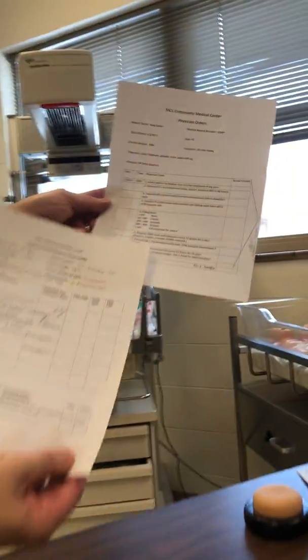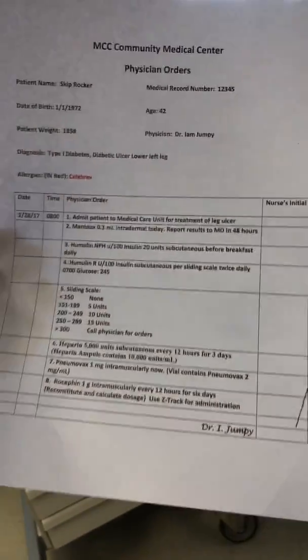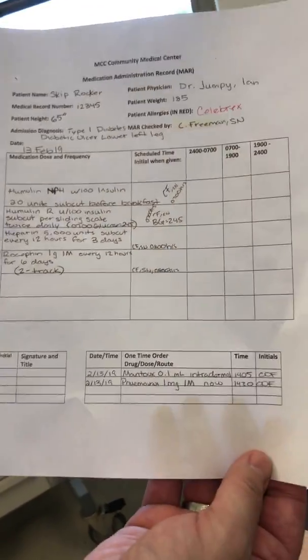I am Brandon Roth, and I'm a student nurse, and today we are going to do an intradermal injection of Mantoux, 0.1 milliliters. We have our physician's orders here. Those orders were transferred in by Carl Freeman, student nurse, into our medication administration record, which is our MAR.